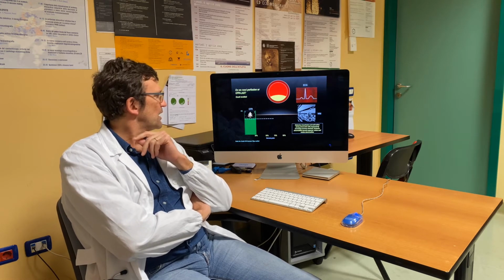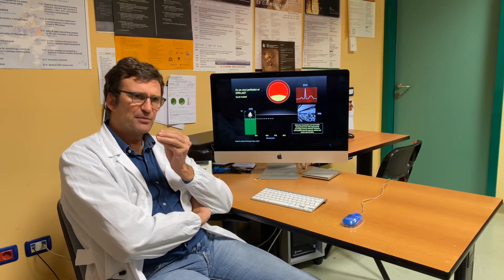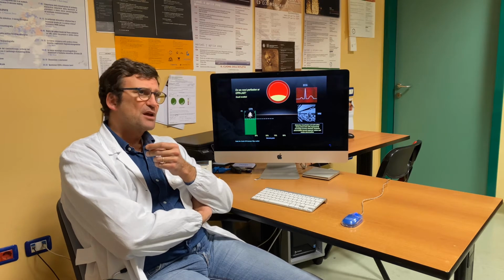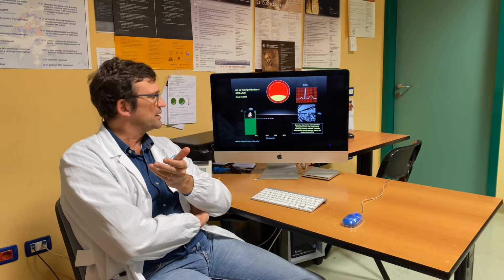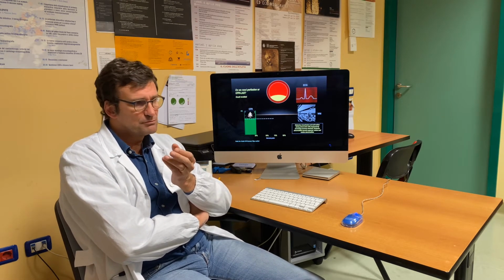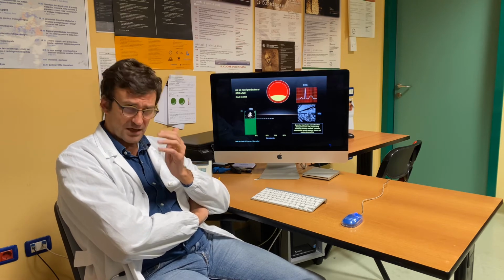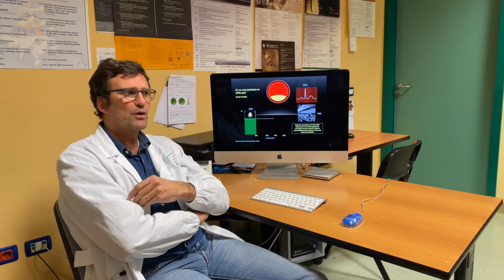Yes, obviously sensitivity and specificity build up the accuracy of the test, but often this is a trade-off, clearly. The use of more than one parameter to assess the coronary circulation helps a lot in terms of sensitivity, but it will bring down specificity a bit. The trade-off is positive overall, and you have higher accuracy. So there are a bunch of studies that were able to demonstrate this.